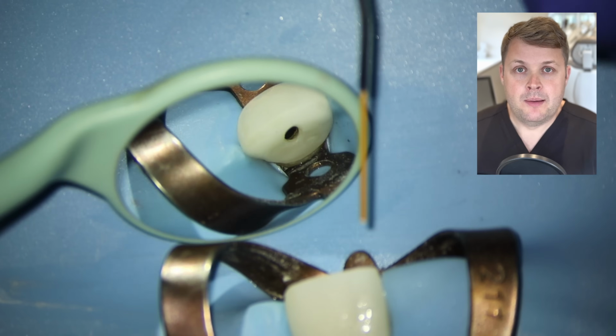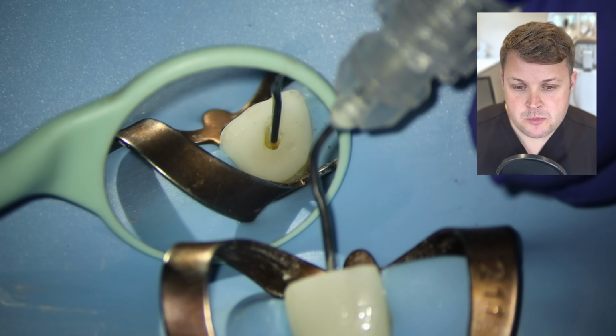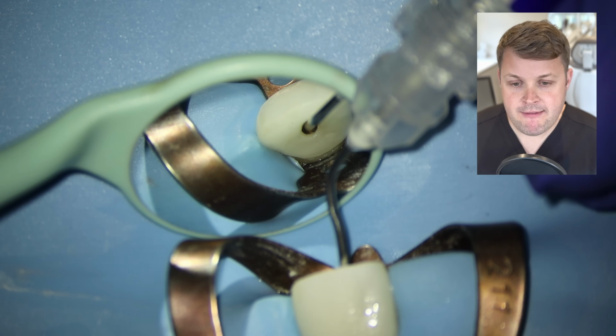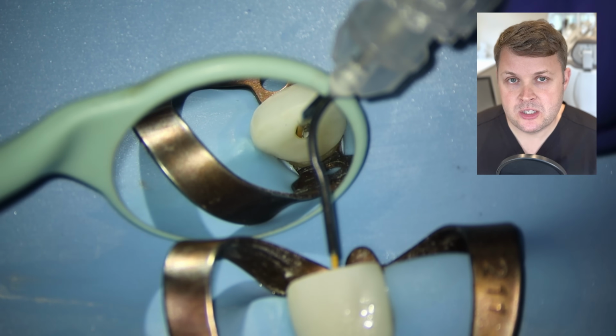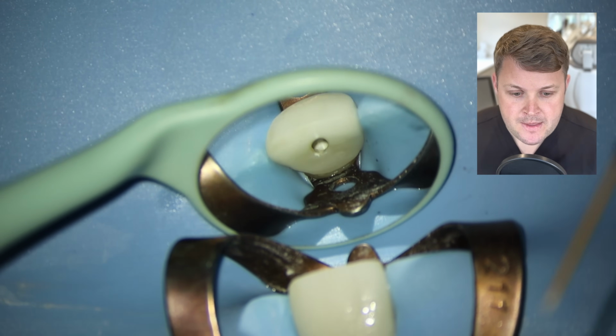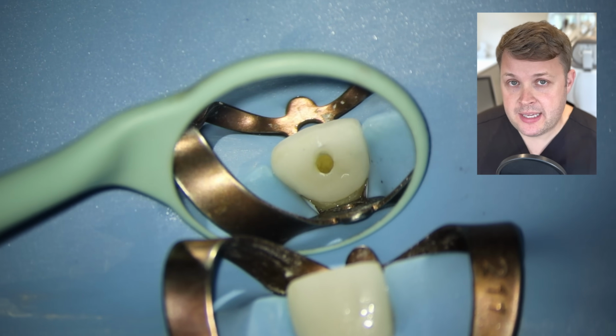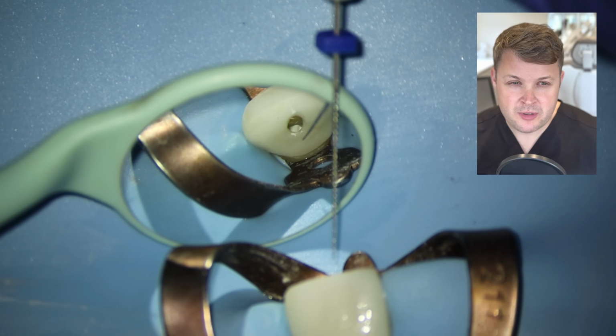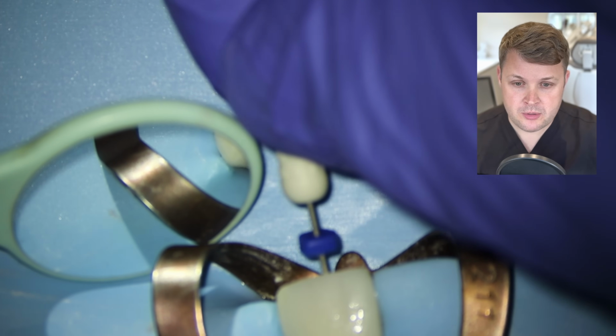And then I'm going to backfill the canal space with our Bioceramic. Directly injecting Bioceramic into the canal space should only be done with direct vision with a microscope. And then once the Bioceramic is being injected into the canal space, I like to do the apical third, coronal and mid.